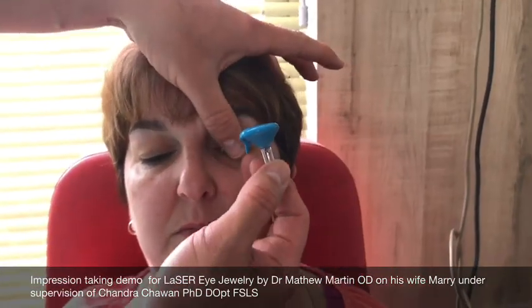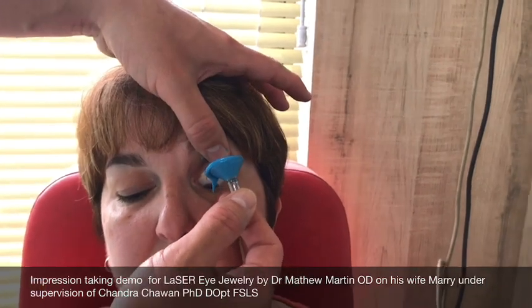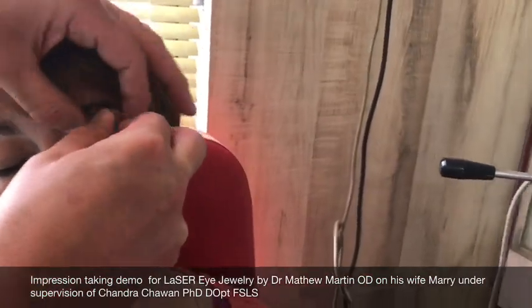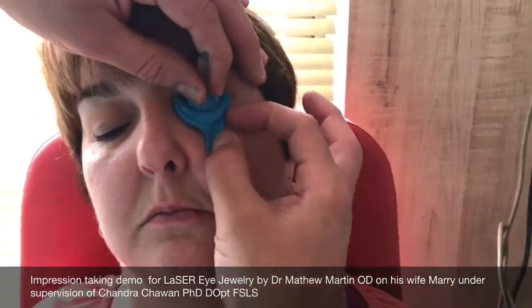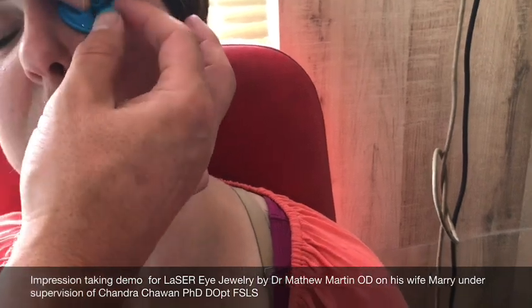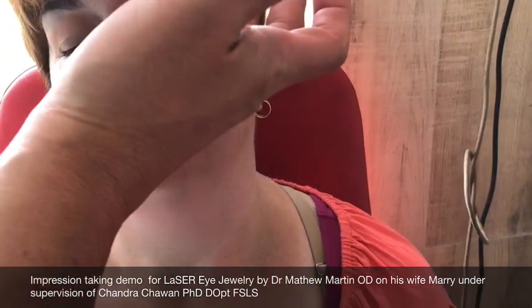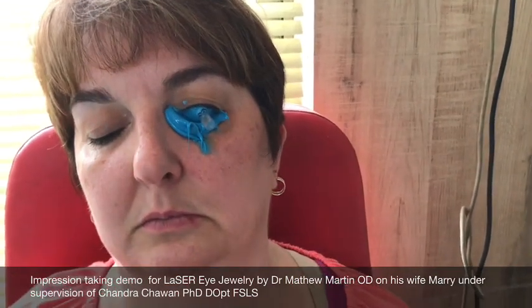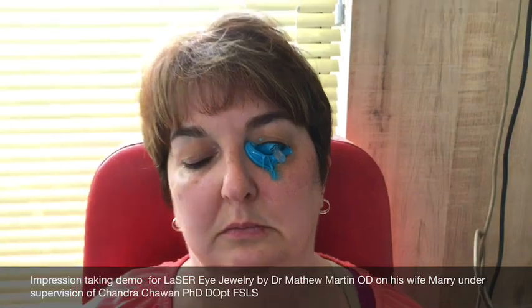We're going to lift this upper lid up, and we're going to insert this underneath the upper lid. Then we're going to reach down to the lower lid, we're going to pull that lower lid out, right like that, and then we just let this sit. It should take just a while for that to do its job — I did get that lower lid out of the way. I feel as though it went in there well enough; it's okay to find out shortly.